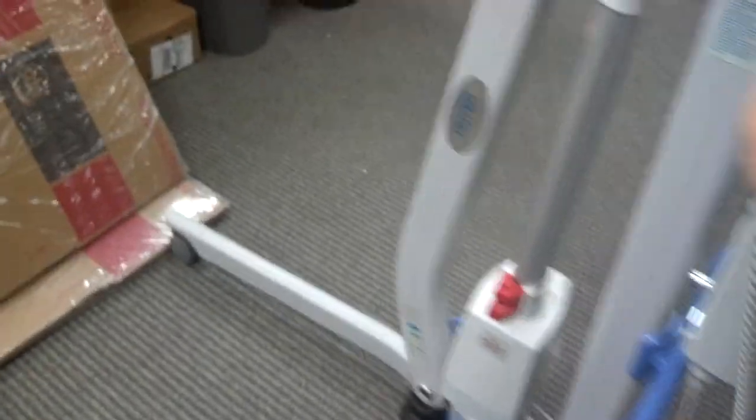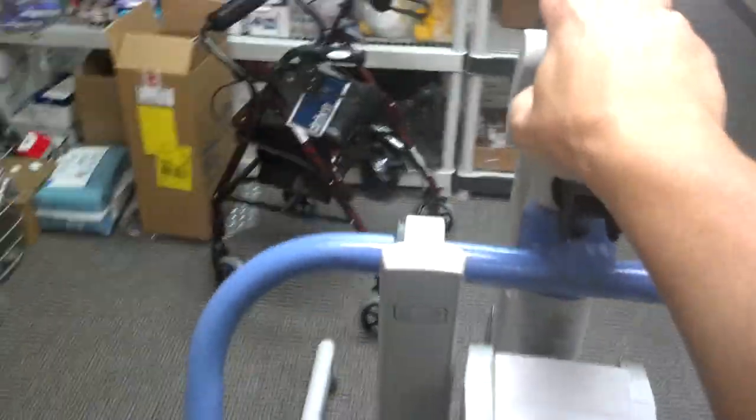It's extremely easy to work — this is probably one of the easiest lifts that I've been able to maneuver. And this is just basically one hand pushing it.